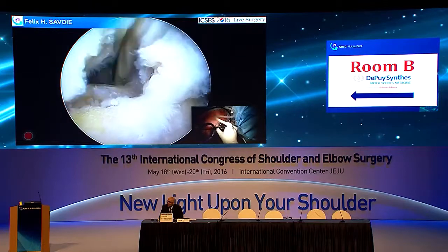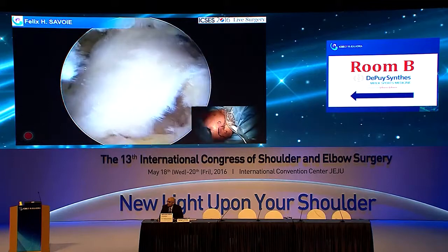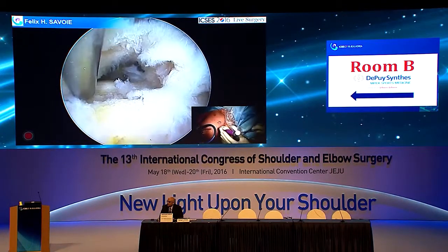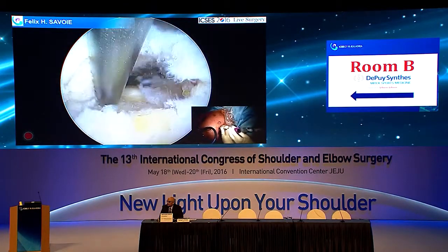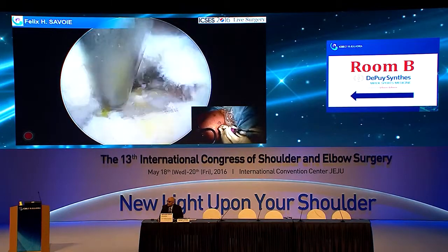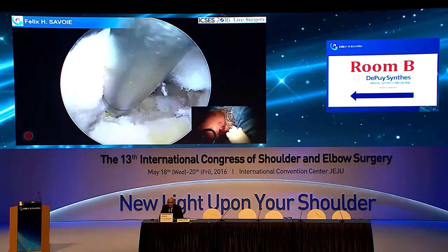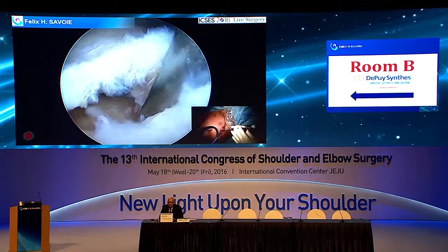Usually I cut it when I'm doing a rotator cuff repair because I think it tethers your repair. After you repair it, you can see it kind of tethers. It's usually inserted in the rotator interval or the supraspinatus anterior margin, so it's aberrant, and I'm not sure if it has some role on the repair or on your exercise post-op. Do you cut it? Yeah, I usually do, just because I don't want to have an additional pain generator, and so many of mine, let's put one more here just for blood supply purposes.